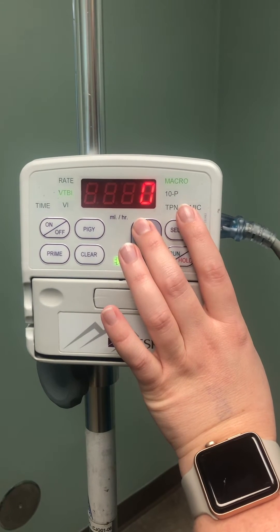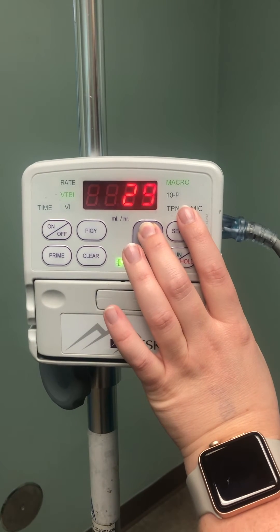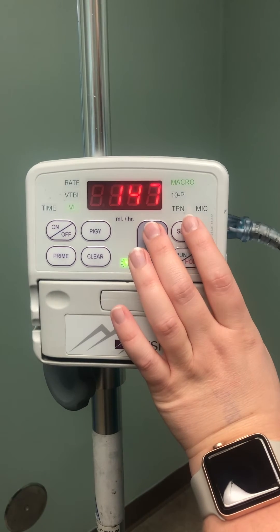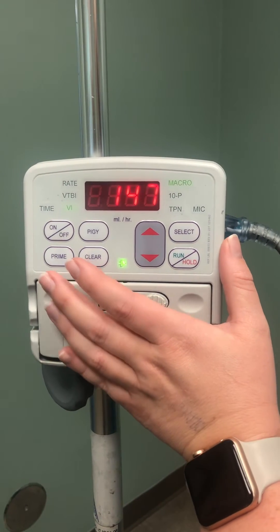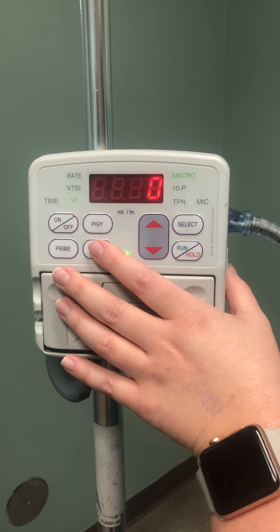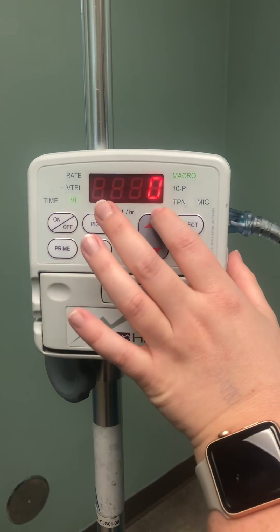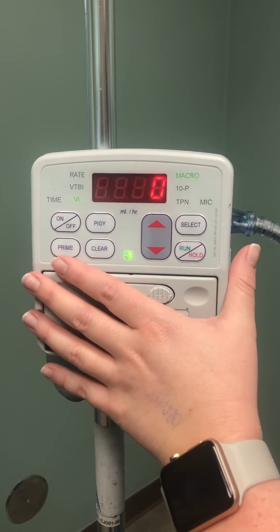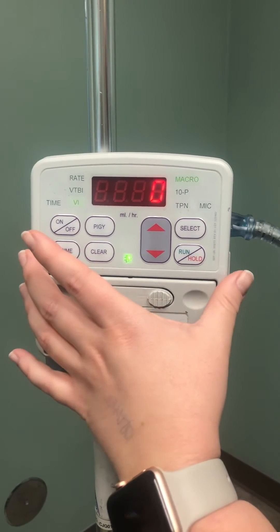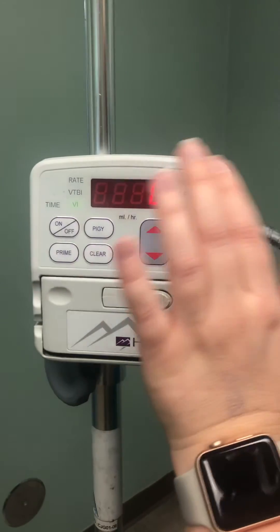But if you have, for instance, a dog that you only need to give 50 mils of fluids to, you can actually go up to that 50. The really important thing on this machine is your volume infused. You need to make sure that when you are starting a patient on fluids, this is cleared. If we have a cat that is blocked and we need to measure the ins and outs, the volume infused is the total amount of fluids that cat has received since it's been on this machine. If the volume infused shows 300 and we just started it on fluids, it could mean the pump is not working, the rate was wrong, or it got too many fluids. Make sure your volume infused is cleared on all patients when you start them on fluids.